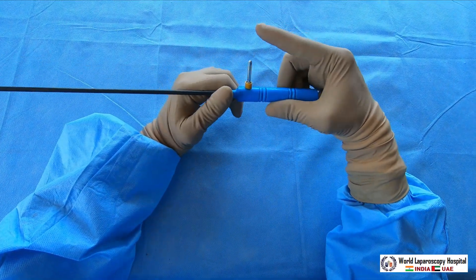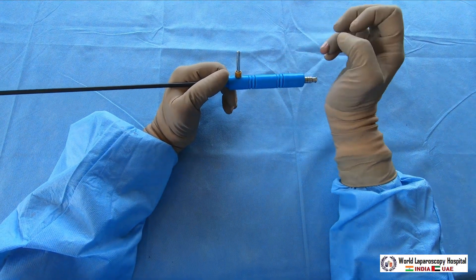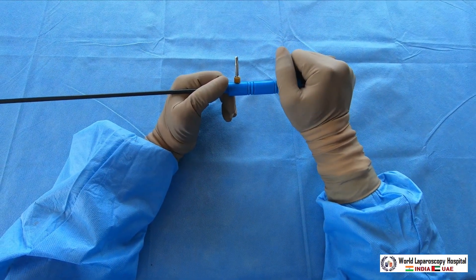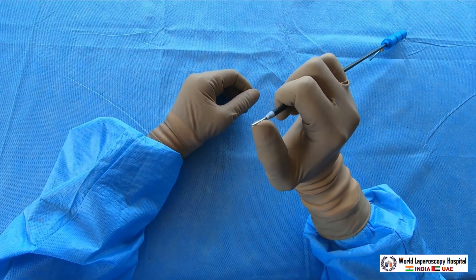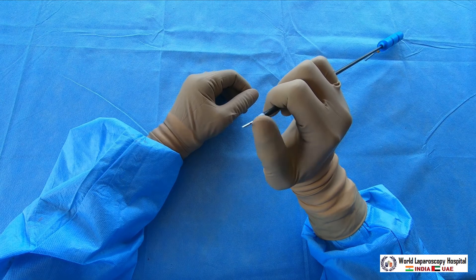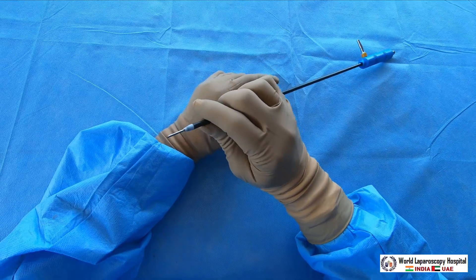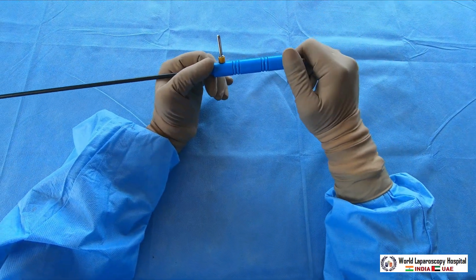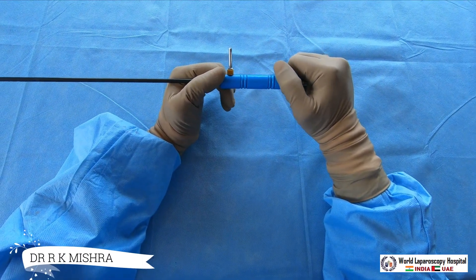You can also attach monopolar current. Sometimes if you don't have a PCOD needle, you can use it for ovarian drilling. Take care that only 4 mm of this needle should be introduced into the ovary — the entire needle should not accidentally pierce the ovary, otherwise there will be a lot of injury to the ovary.